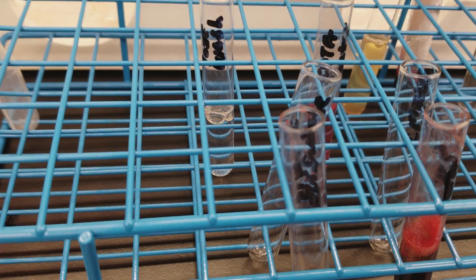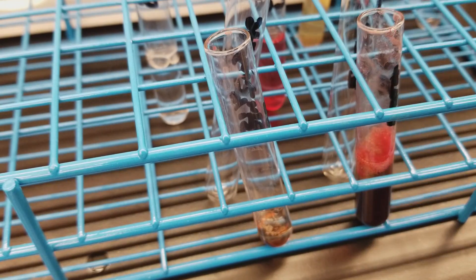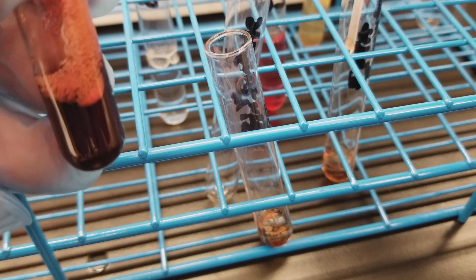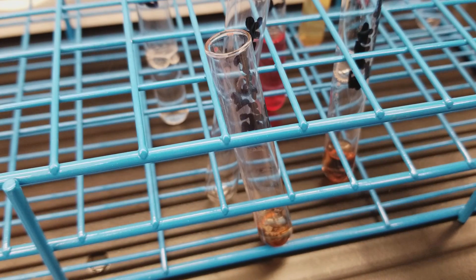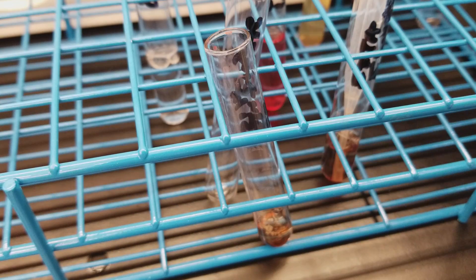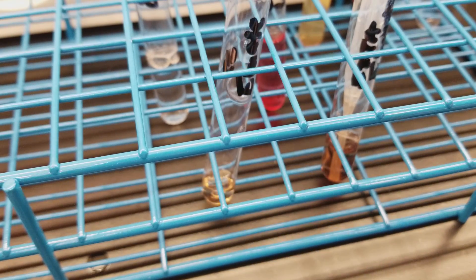Now we're going to remove that supernatant and put it into a new tube called Eluate. I want to make sure not to have the red blood cells in there, because we're actually going to get rid of the red cells that are left after we pull all of this off. I'm going to throw these into a sharps container. Look how little that is — we're putting that in there and getting rid of it.